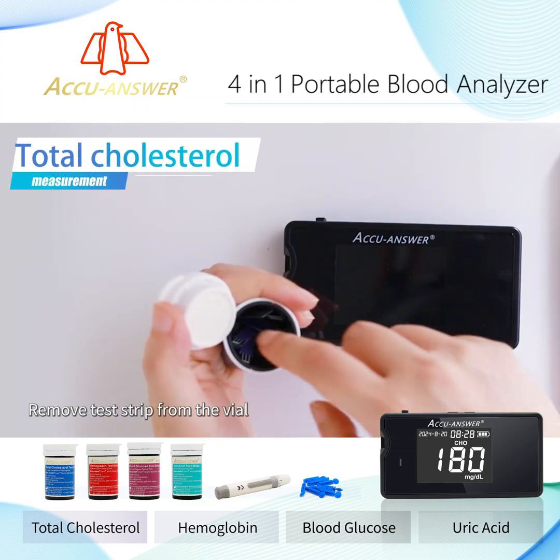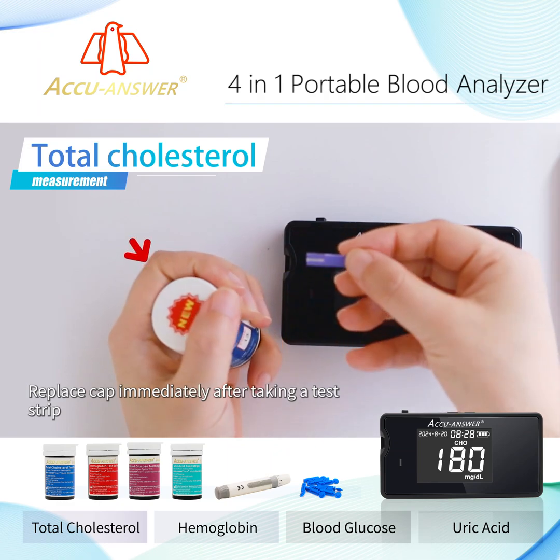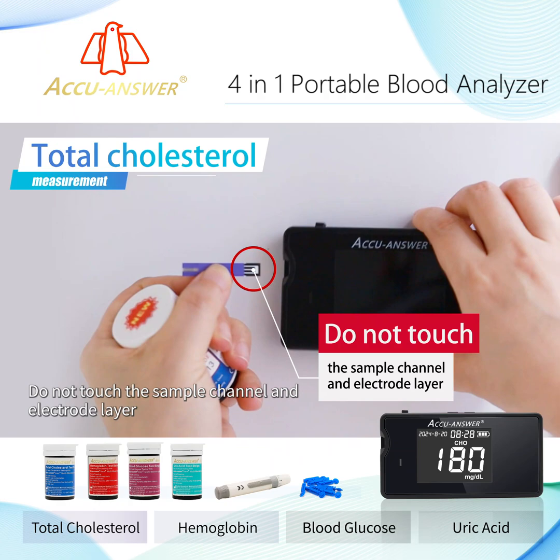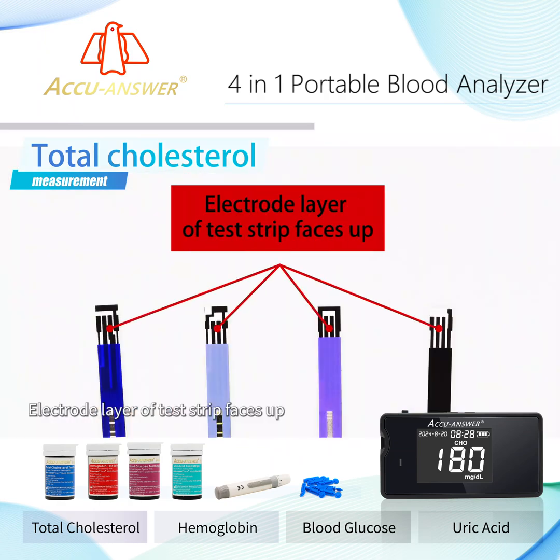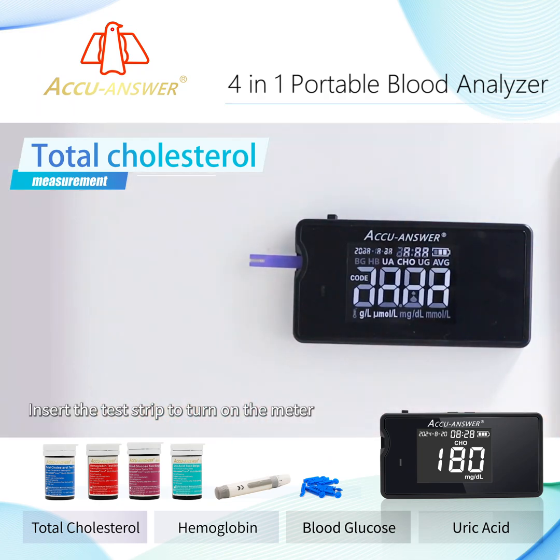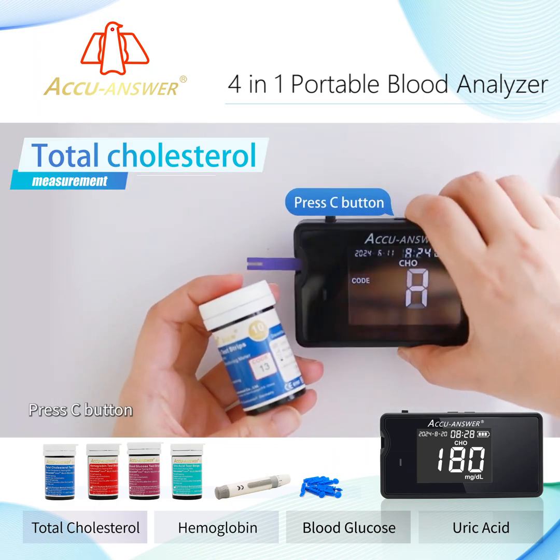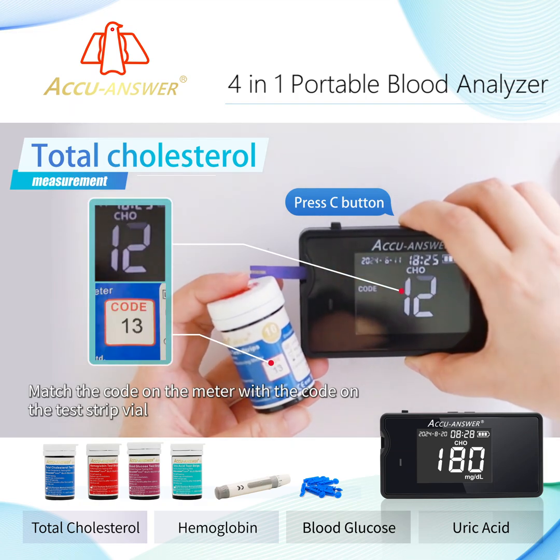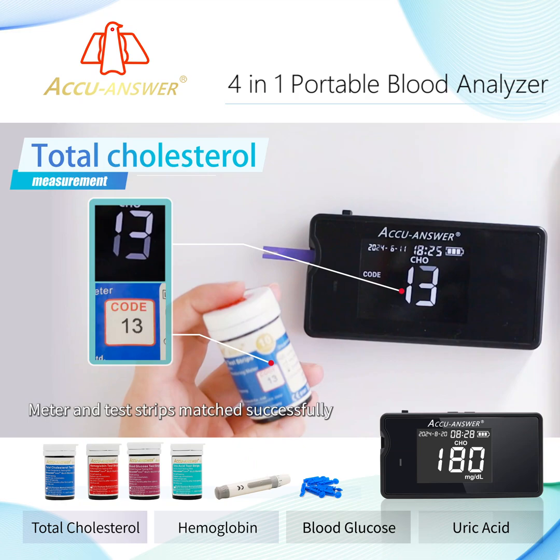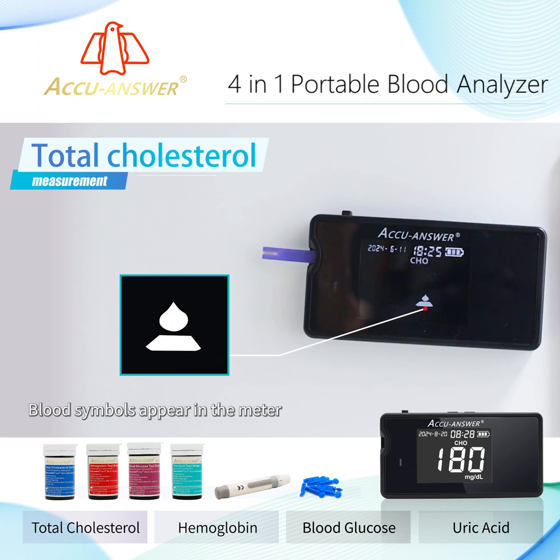Remove the test strip from the vial and replace the cap immediately after taking a strip. Do not touch the sample channel or electrode layer. The electrode layer of the test strip faces up. Insert the test strip to turn on the meter. Press the C button and match the code on the meter with the code on the test strip vial. Once matched successfully, blood symbols appear on the meter.